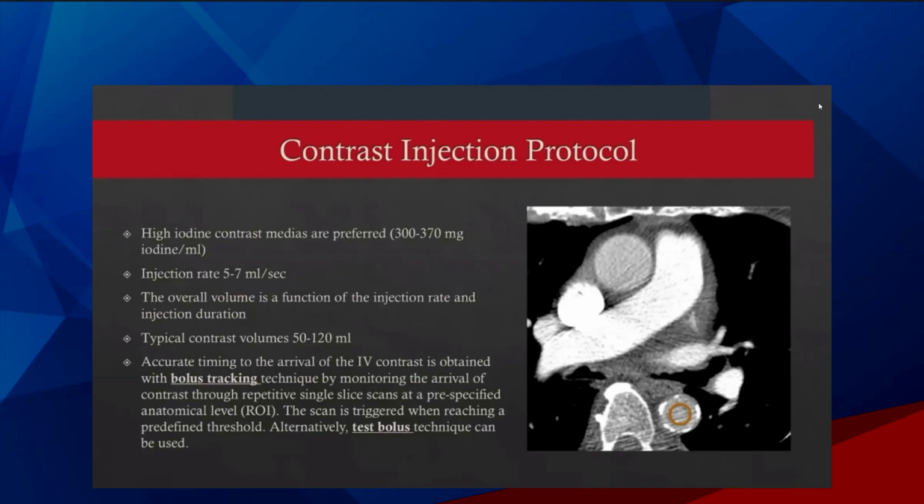As far as test boluses, sometimes people use them, but to me, that takes a little bit more time. I would just like to make sure we have a nice rate of injection and the contrast is going well. I like to start mine manually so I can better guide what happens as far as the contrast flow and when to start a scan.